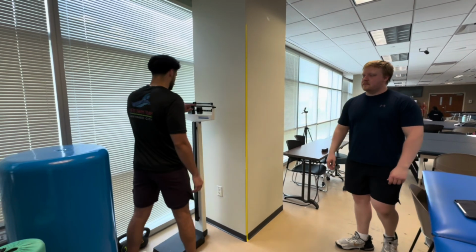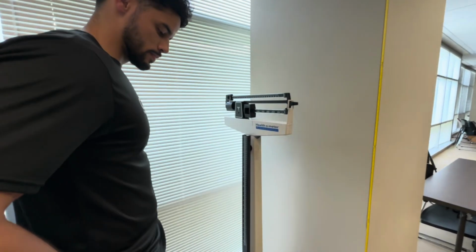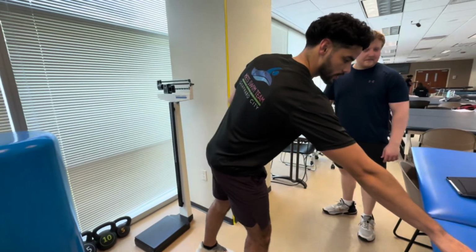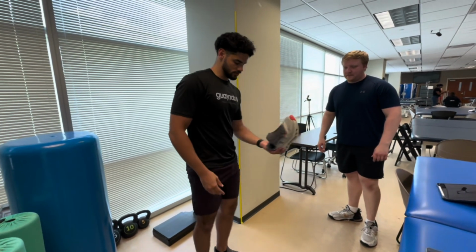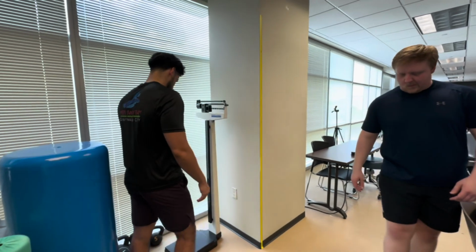In this clip, I instruct John to remove any bulky items he might have in his pocket and also to remove his shoes so we can get the most accurate reading of his weight. I then adjust the scale to the nearest 0.1 kilograms or 0.2 pounds and then take his measurement.